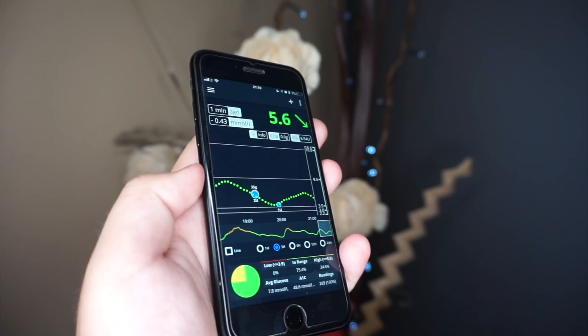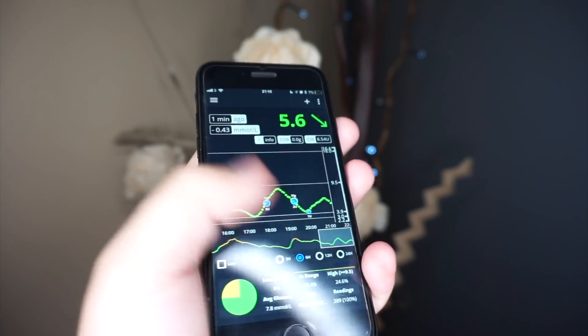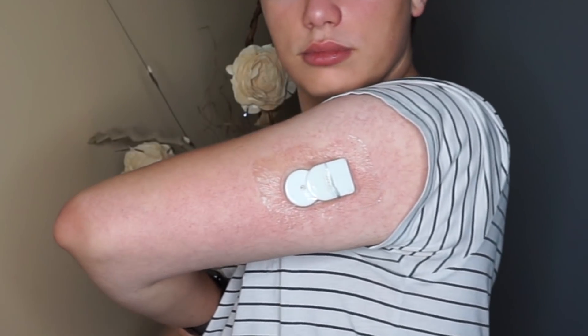Do you want to have low and high alarms but you are using the Freestyle Libre and you think that it's impossible? Well, then you are in the right place to learn everything on how to turn your Freestyle Libre into a real-life continuous glucose monitor with alarms.